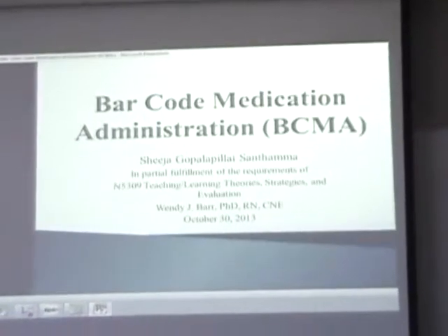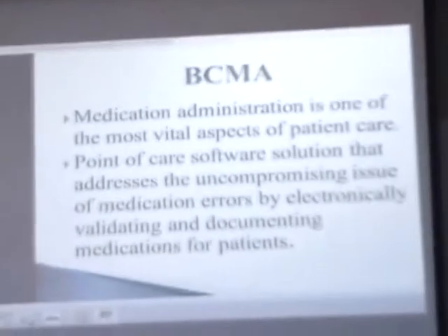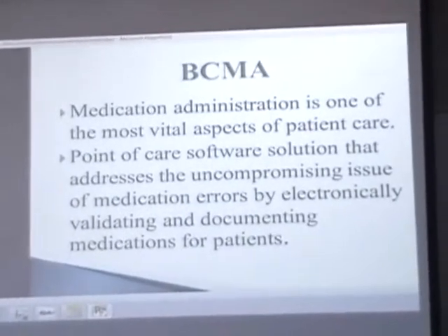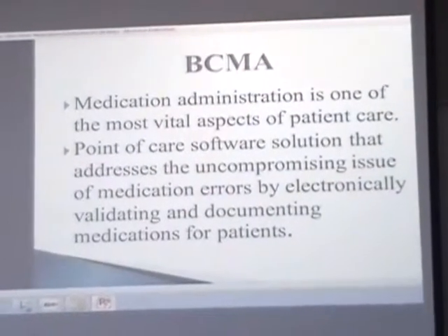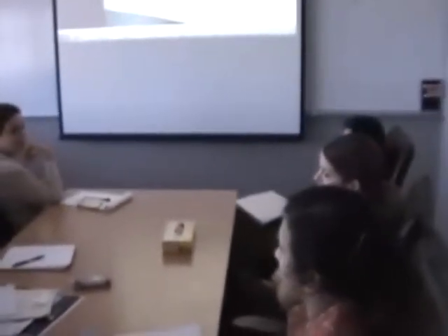Today I'm going to do a short demonstration of the barcode medication administration workflow that we follow in our organization. You all know the importance of BCMA. Medication administration is one of the most vital aspects of patient care. So can anybody state what BCMA means? Use of a scanning device and barcodes for identification of medications in patient.